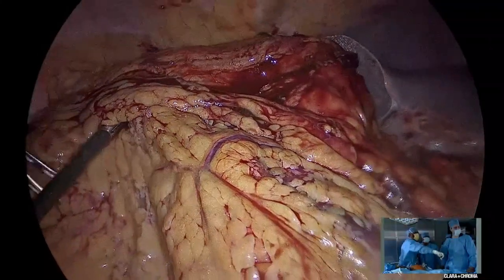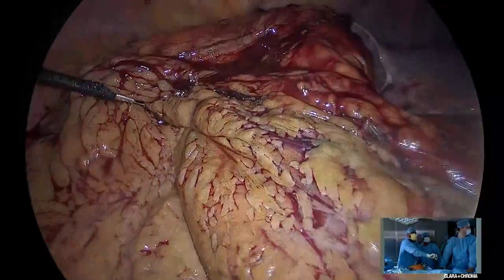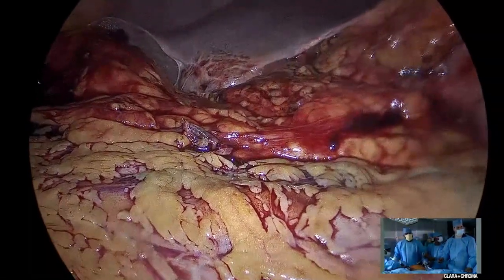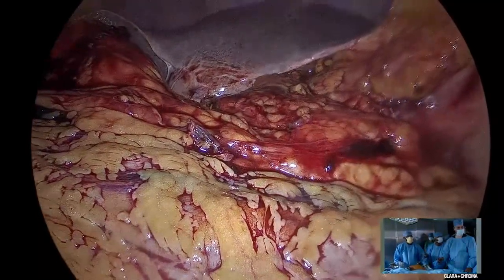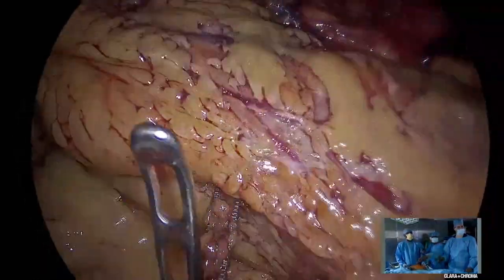Yeah. But this is generally our practice. I mean, this is a very good idea. This is what we generally do, that we divide the ileum early. Correct. So that subsequently we are taking it for the anastomosis. Correct. We know that its vascularity at the end is not compromised. Correct. Yes, sir. I do that too.